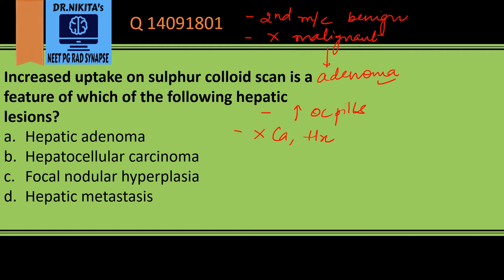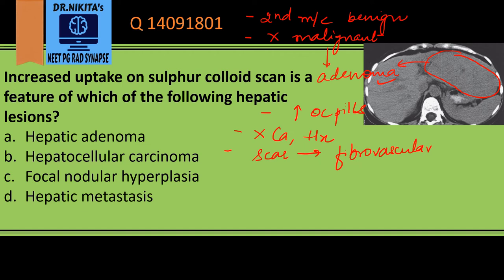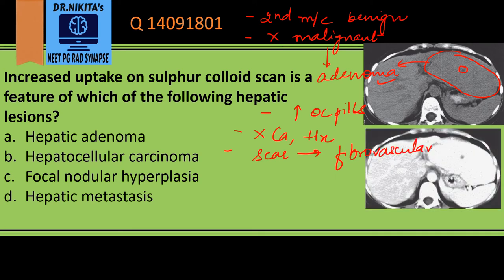FNH shows a central scar, which is a fibrovascular scar. Looking at the CT image now, this is a lesion that looks the same as liver parenchyma because it contains normal liver elements — it has the same density. In the center we can see a hypodensity, which is the scar.